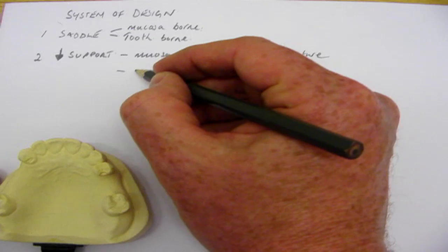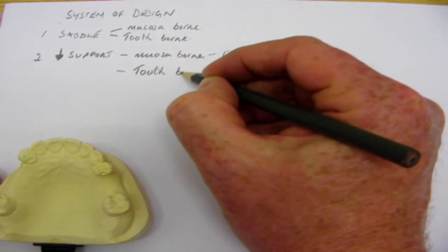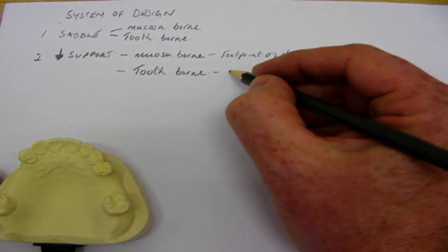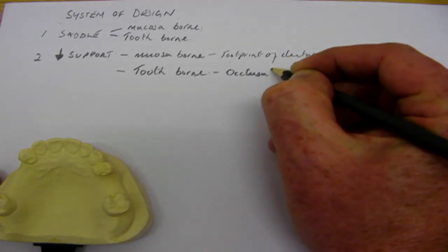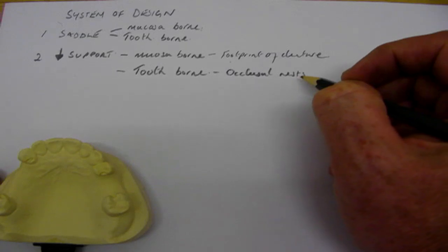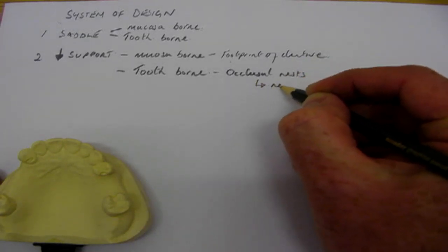If we're doing a tooth supported denture, so tooth borne denture, then we're going to design in occlusal rests, and occlusal rests are the metal components that sit on top of the teeth, typically in rest seats.